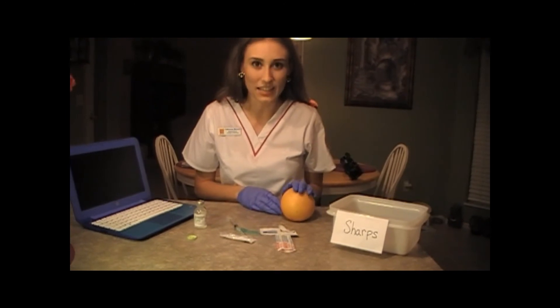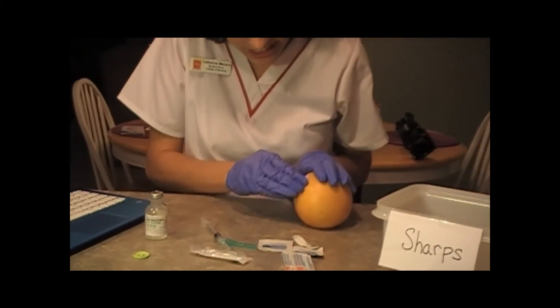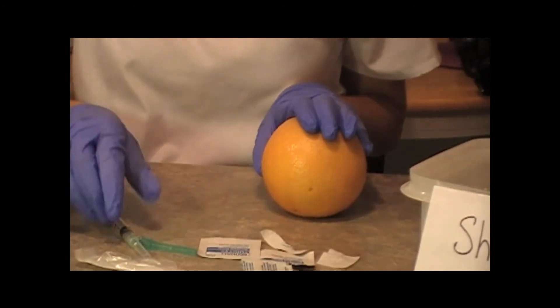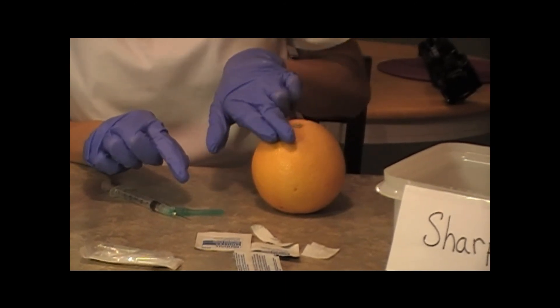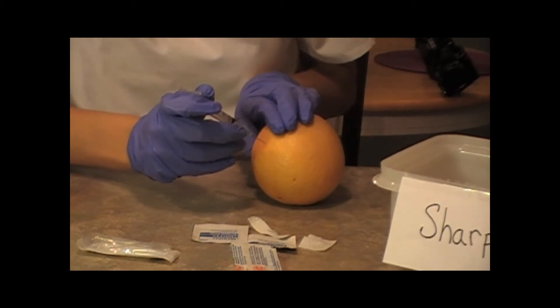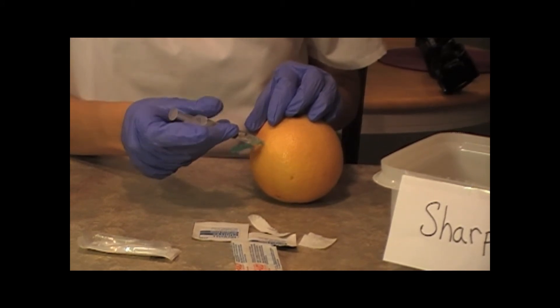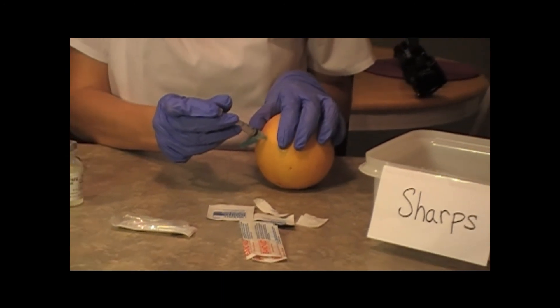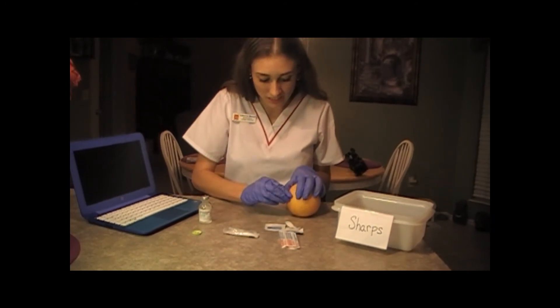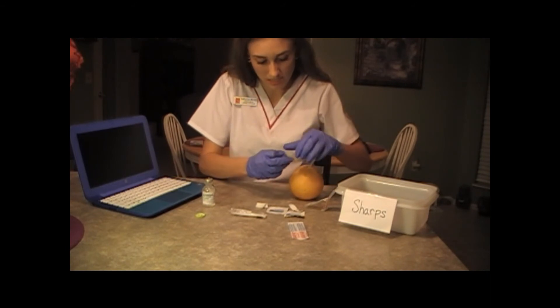After confirming patient identifiers and checking for allergies, I'm going to clean the area really well, going from the inside outward with the alcohol wipe. I'm going to pop my cap off, find their acromion process, and go about two to three finger lengths below that to find my injection site. Then I'm going to inject my medication at a 90 degree angle, but first I'm going to pull back and aspirate to make sure I'm not in a blood vessel and there's no blood in my needle. Since there's not, I can go ahead and inject my medication, hold it there for about 10 seconds, then pull my needle out. I'm going to dispose of my needle in my sharps container, clean off the spot with my alcohol wipe, and if necessary put a bandaid over the site.